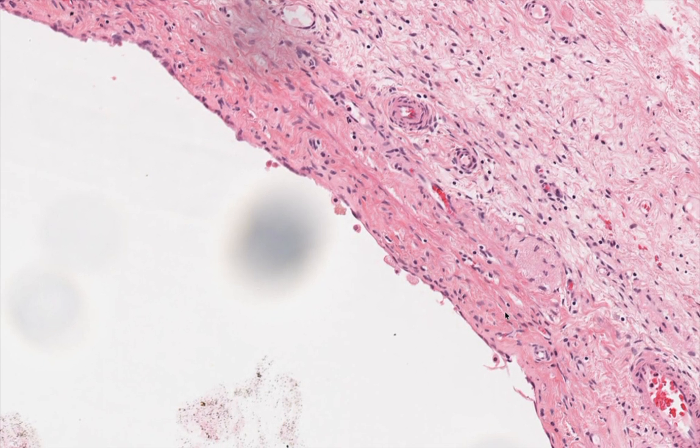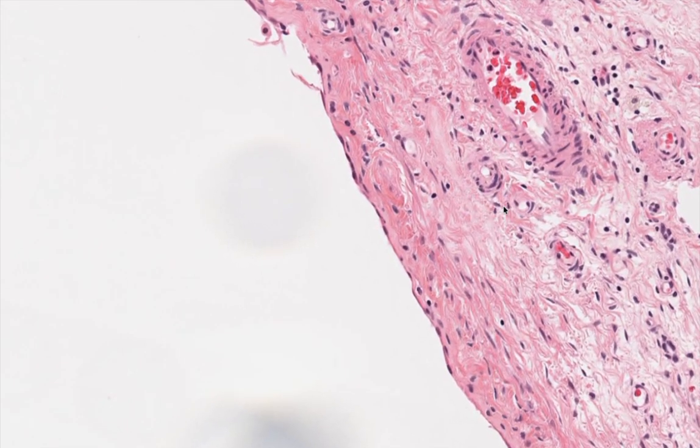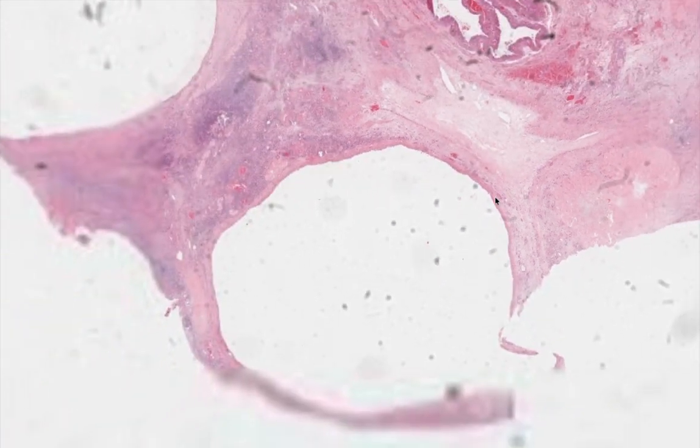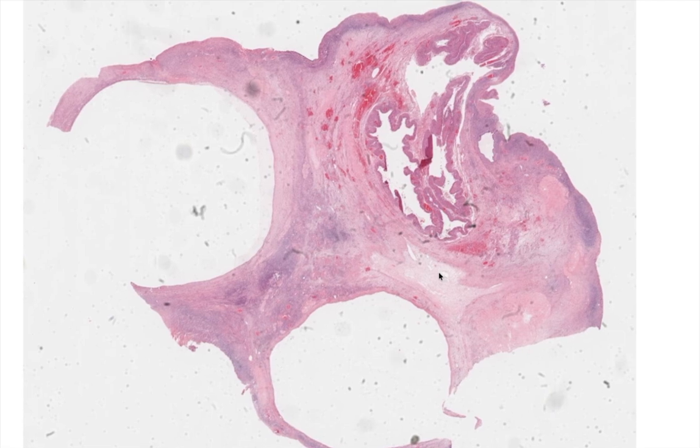One thing we want to do is really just make sure that there is no endometriosis around, but no, there is no endometrial stroma. So there we go. An ovary which is normal but has four normal but different cysts in it.